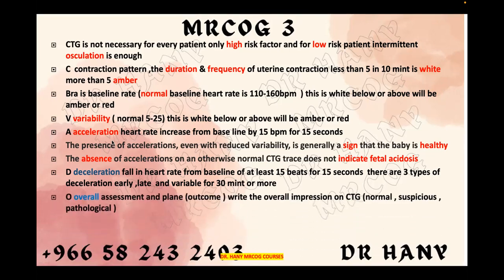There are some concerning characteristics which happen in the decelerations: if you have loss of shoulders before and after the decelerations, loss of variability in the decelerations, or going back to a lower baseline or does not recover to the baseline. These are the non-reassuring signs.